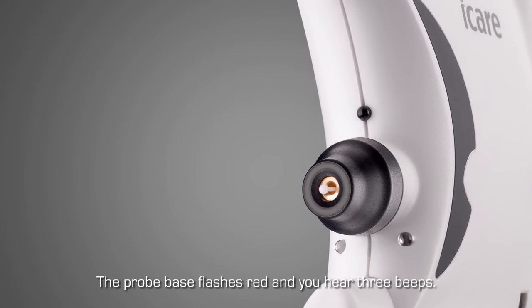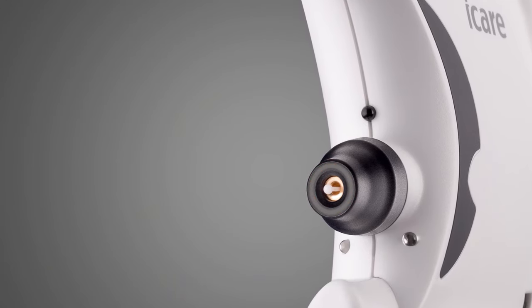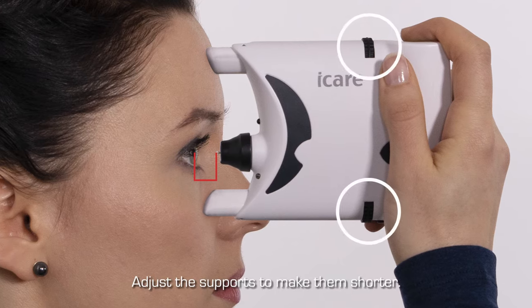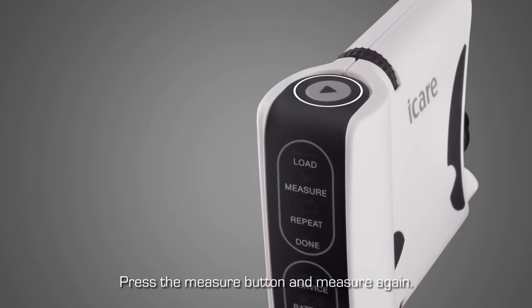If the probe base light flashes red and you hear three long beeps, the device is too far from the eye. Adjust the forehead and cheek supports to make them shorter. Press the measure button and measure again.